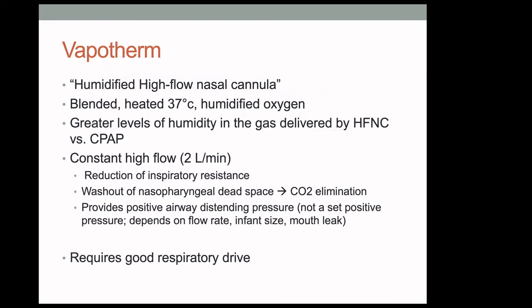With vapotherm, you get a constant high flow. It's different from CPAP because you don't get a set positive pressure, but it does have an impact on the airway distending pressure by producing positive airway distending pressure. You're also washing out any CO2 from the nasopharynx, which helps to eliminate any CO2 retention.